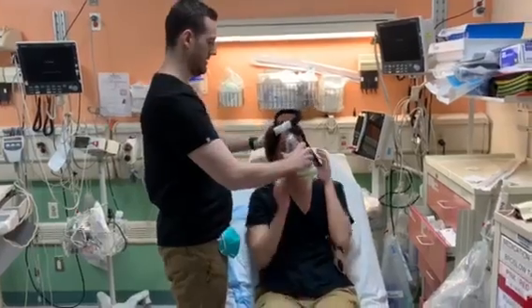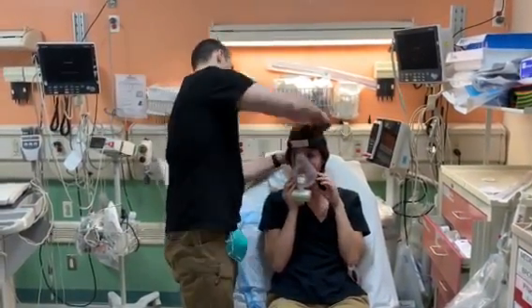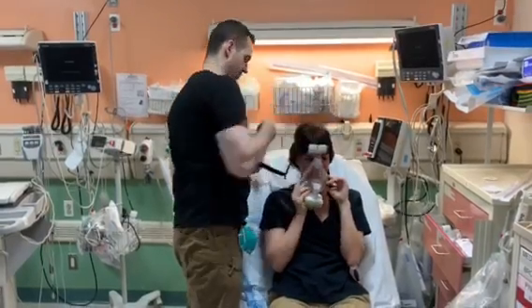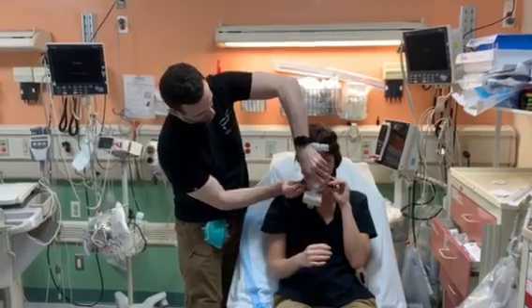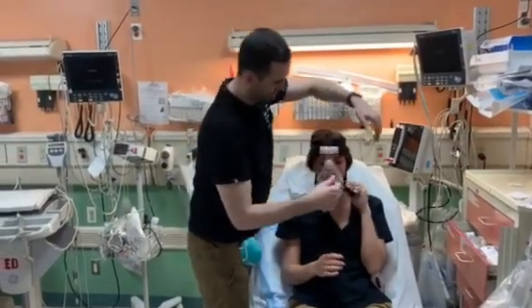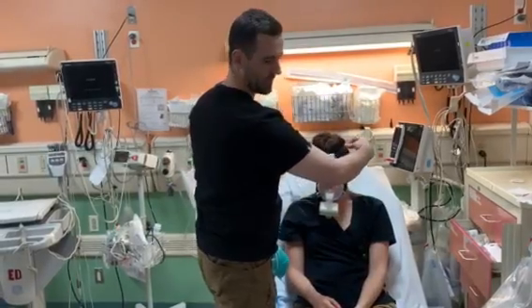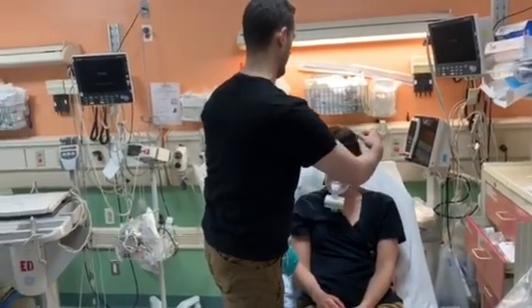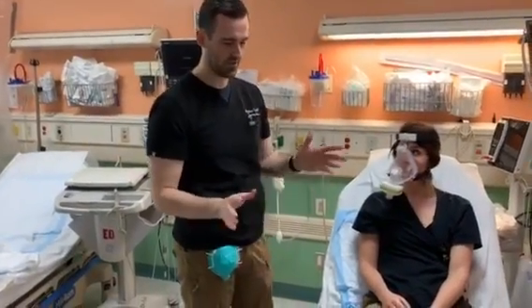So we're going to put this on the patient. She's a good patient so she's going to help me put it on. You can breathe through it well right now, right? We'll just wrap this down quick. It'll feel a little more uncomfortable once we put the PEEP valve on and start giving her oxygen, but right now everything she breathes in and out is already filtered, so she's pretty safe.